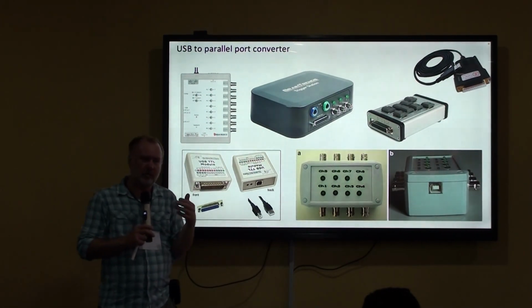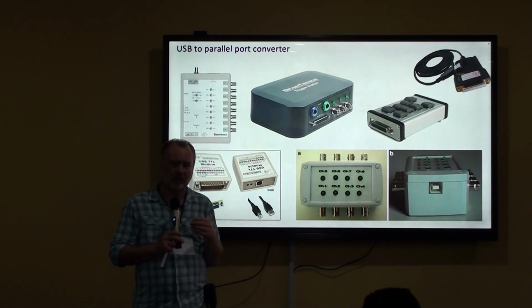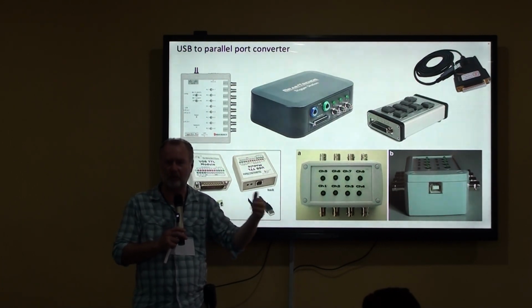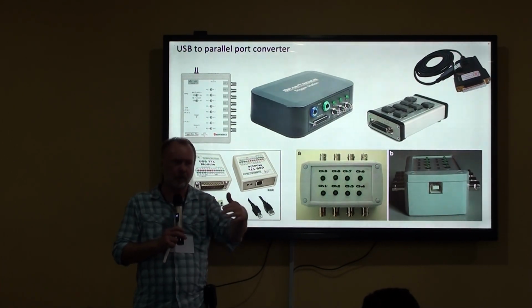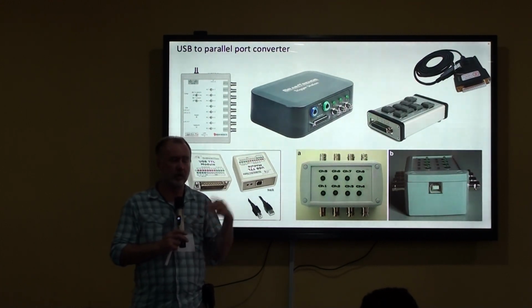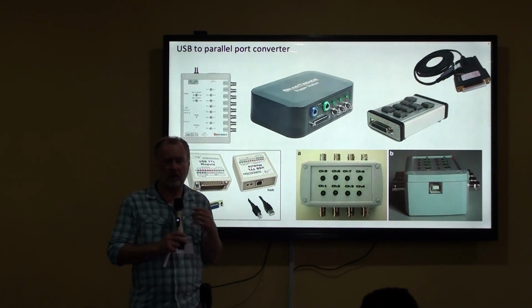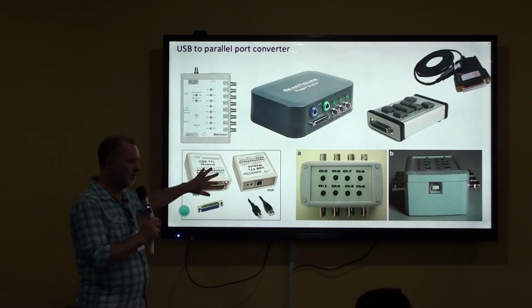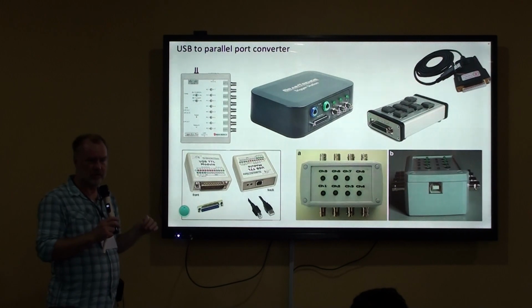So a lot of labs make these trigger boxes themselves. Actually, I would say this is a nice engineering project for engineering students, if you have them at a university, to help with synchronizing the computer with your EEG equipment. You can also buy them. A lot of labs buy them. I think a box like this is a few €100.